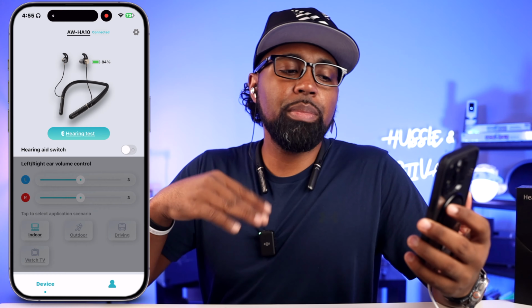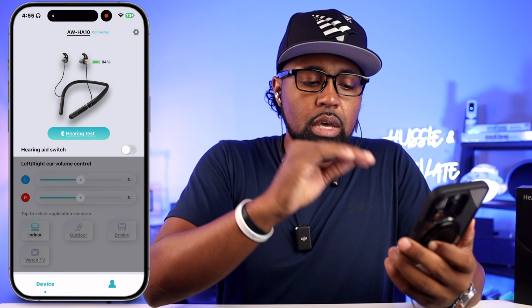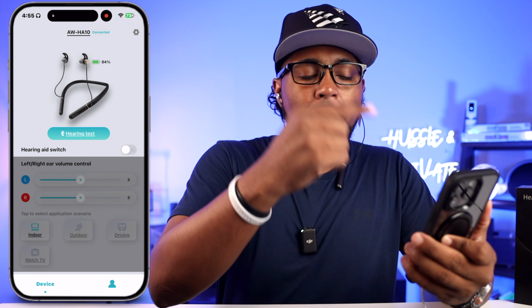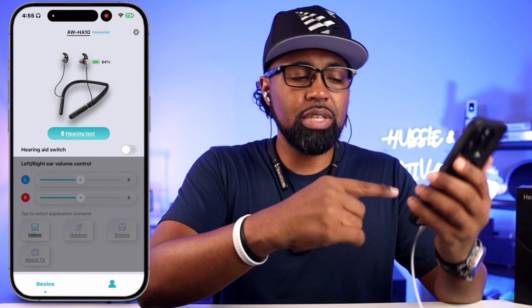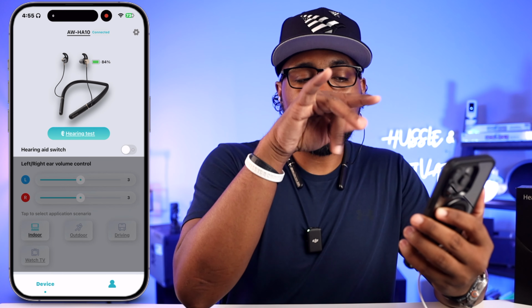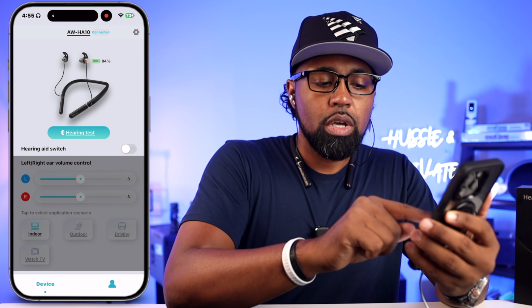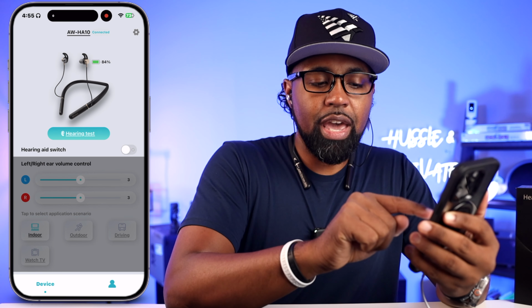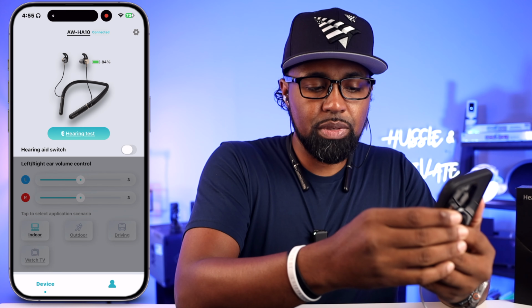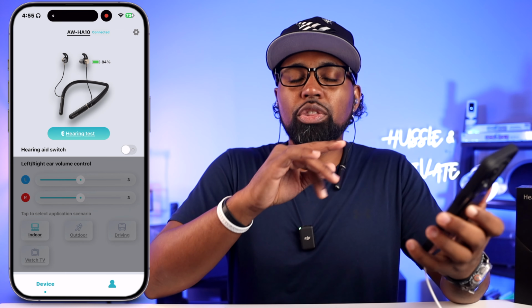All right, people, so I thought because I didn't update the firmware on these earbuds, it wasn't letting me run the app how I want to. So normally in my test, when I run through an app, I record my phone screen right here, as you can see, and then also I will run through the app so you can see everything. But as I'm recording this screen right now, I'm not able to move the hearing aid switch over and have it stay over like that. So it just keeps jumping back over and popping back over because I'm recording my screen right now. But let me just run through this app real quick.